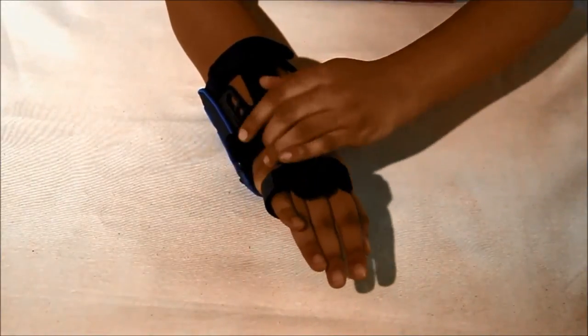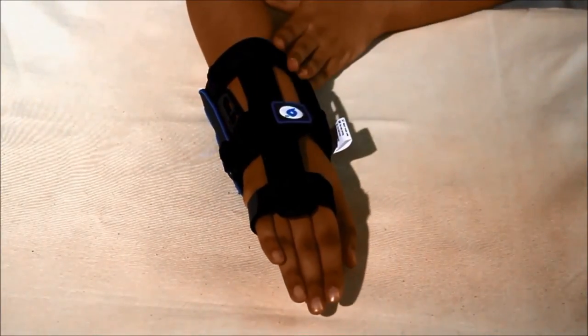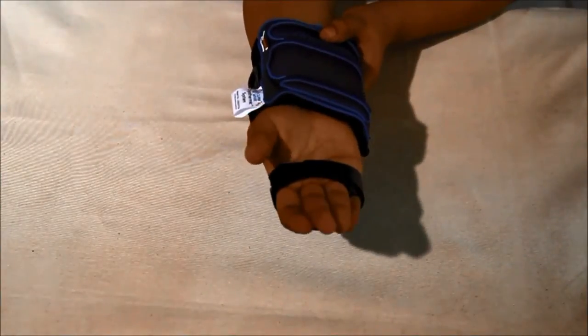This is how the wrist wrap looks after wearing with the immobilizer. The immobilizer can be removed conveniently to allow mobility.